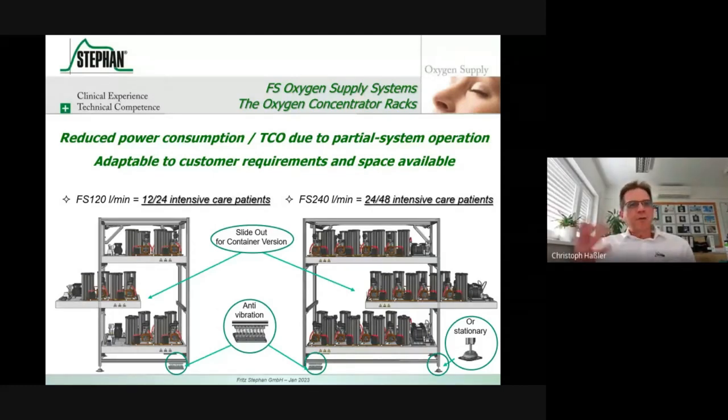Yeah, support. Either our support technicians go out and do the maintenance, but most of our customers like to get training here and have technical personnel, most of you, as I understood, do their maintenance on their own. They buy just the maintenance sets, the piston rigs, the membranes, and what's necessary for the pre and post compressors, and do their maintenance on their own.